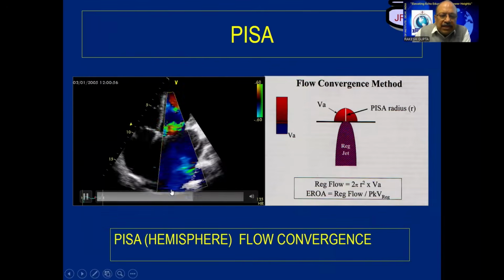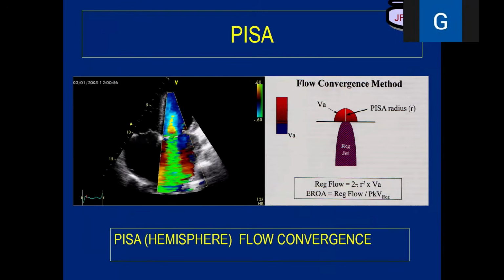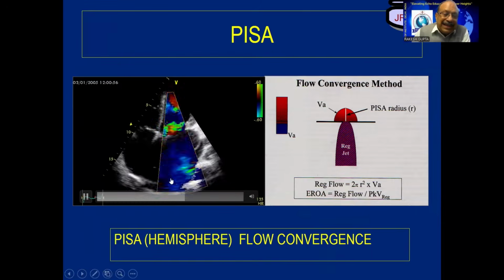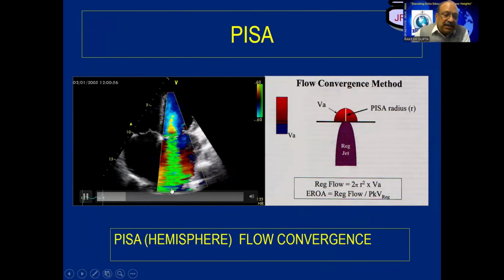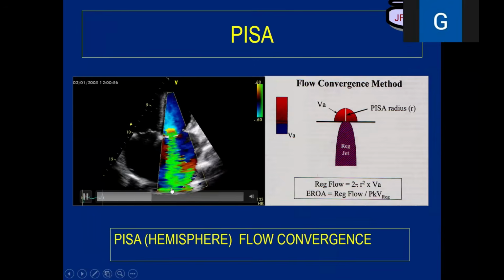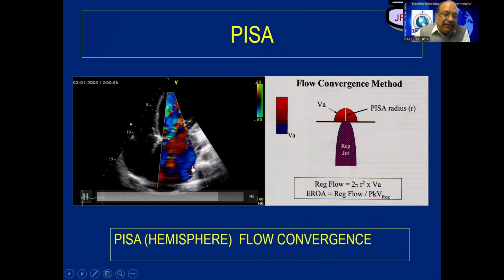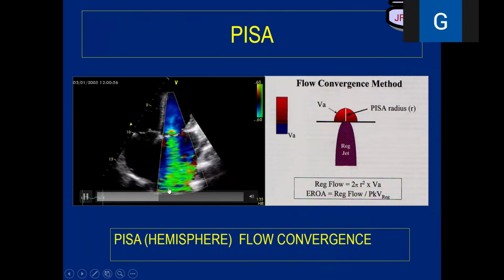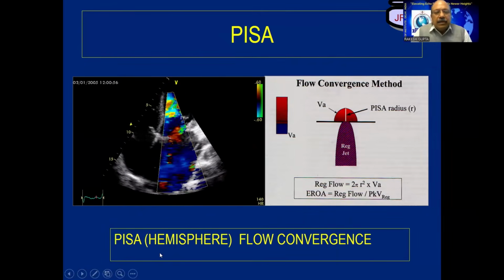In the four chamber view, here is a pulmonary vein. So put a pulse wave Doppler sample volume not in the LA, superior surface, but inside the pulmonary veins. Normally, what we are seeing is the right pulmonary vein. Left is over here. We keep it in the right pulmonary vein because we are parallel to the flow.